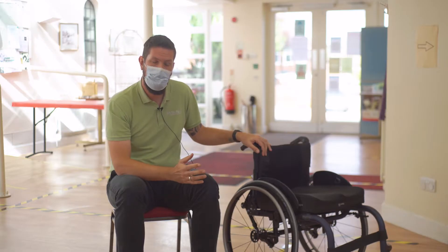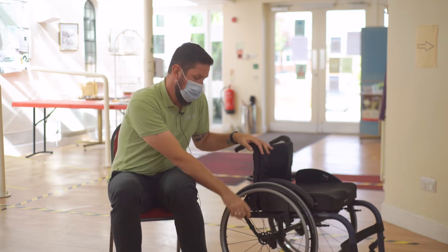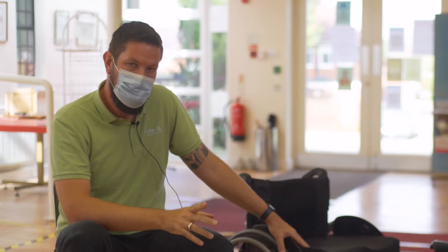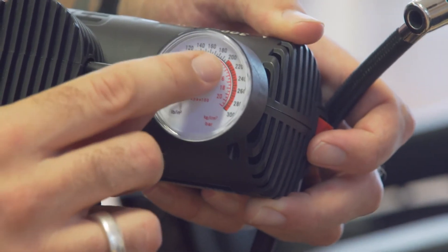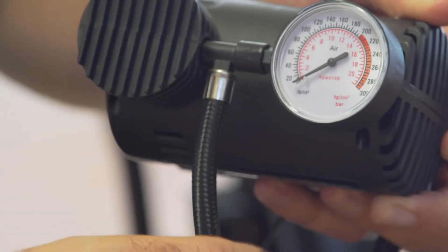I use an electric pump on my van and it's very easy and simple. It plugs into the cigarette lighter. You can then plug it onto the tyre. It has a pressure gauge and you can inflate it to the pressure you require. But you need to make sure that tyre pressure gauge is accurate, as some cheaper models may show you a false reading, so make sure that gauge is working accurately when using the pump.